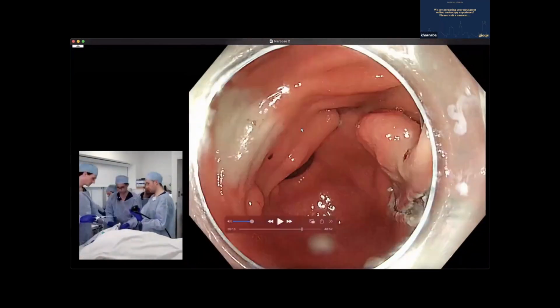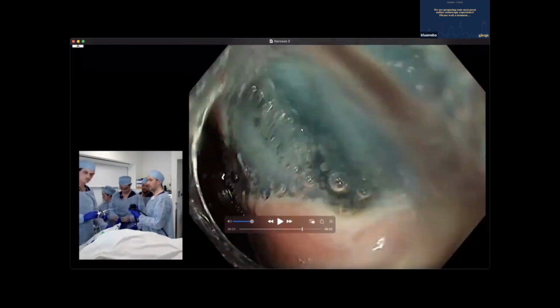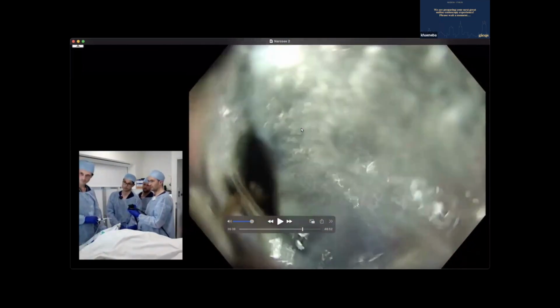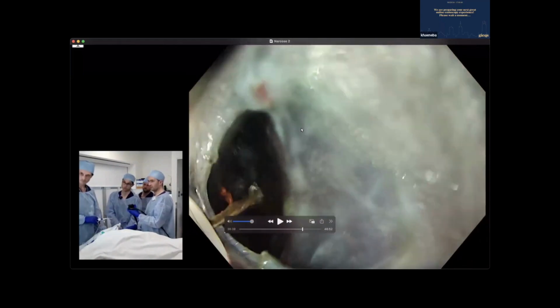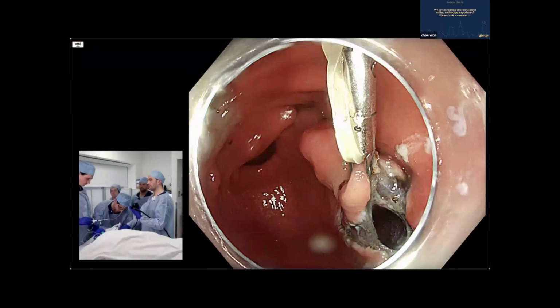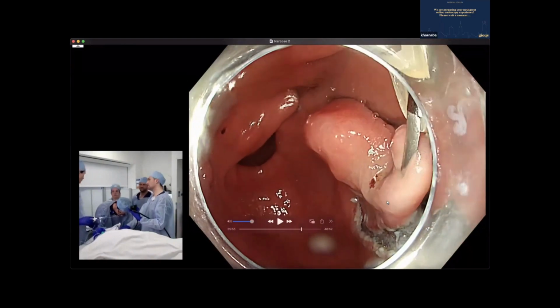Compare that with this. You just had a view right here. In hindsight, I wondered if you would have put it even more up and more to the anal side, if it would have helped you even better. The attachment more to the right and more to the back. Maybe. Yeah, maybe. Anyway, it wasn't so difficult, and I think that wasn't such a problem.